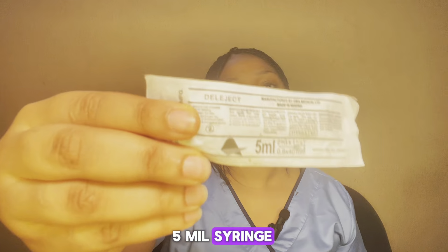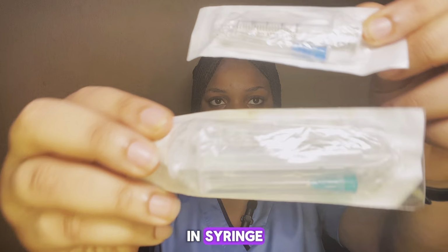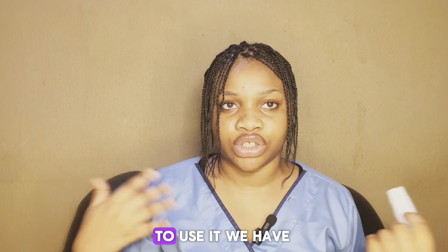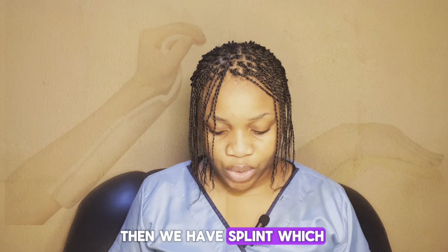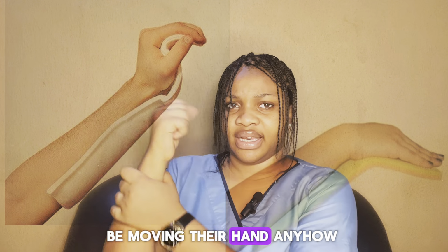Then next we have the water for injection or saline to flush. Then we have 5 ml syringe and 2 ml syringe. Local anesthetic cream, which is optional. You can decide to use it, you can decide not to use it. Apron, which is optional, okay? Then you have splints, which are normally used in children, just like folded carton.